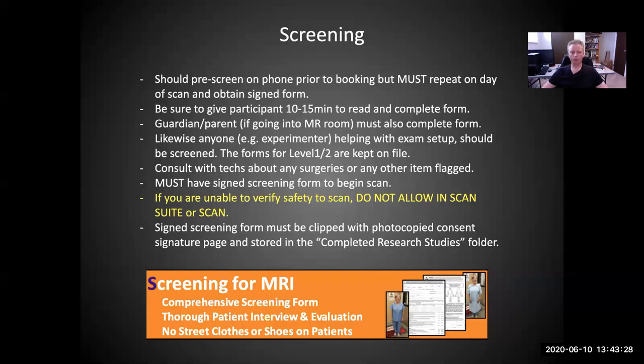You should be 100% confident, or else you should be seeking advice from someone who is confident based on their training and experience. Finally, just an administrative note, we keep the screening form clipped to a photocopied consent signature page and stored in the completed research studies folder. And that's something that you should learn and memorize when you go down to the MR area in our demonstration, because this is required of every study, that this information is filed in order for us to keep track of the studies and ensure that they've completed the procedures properly.